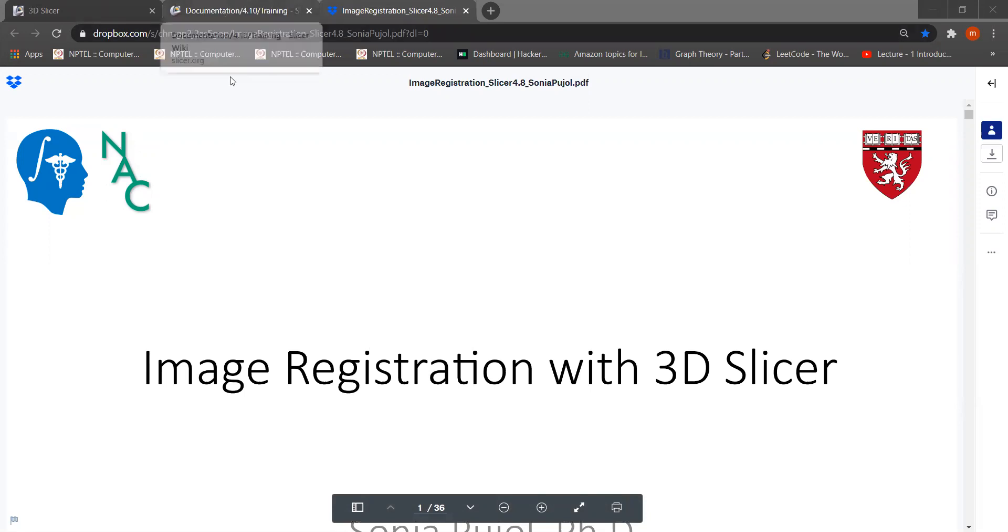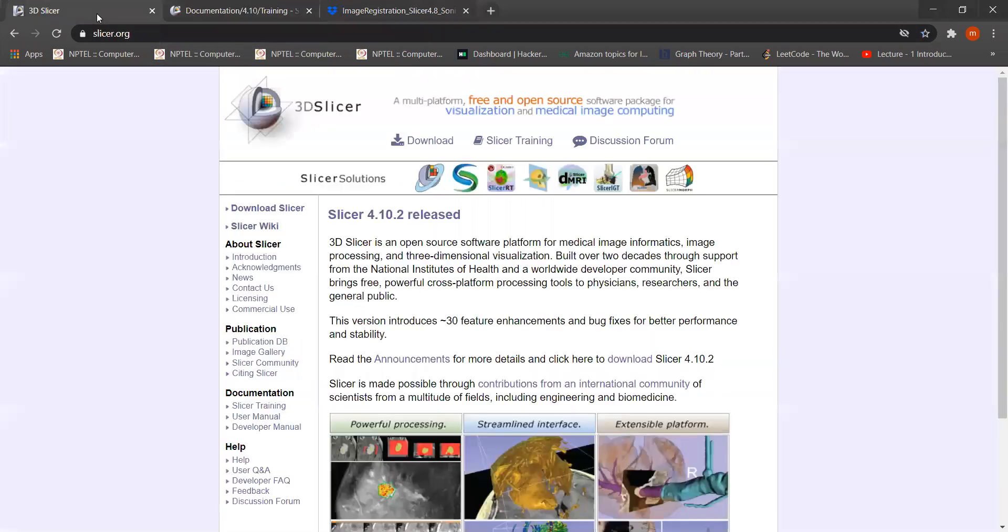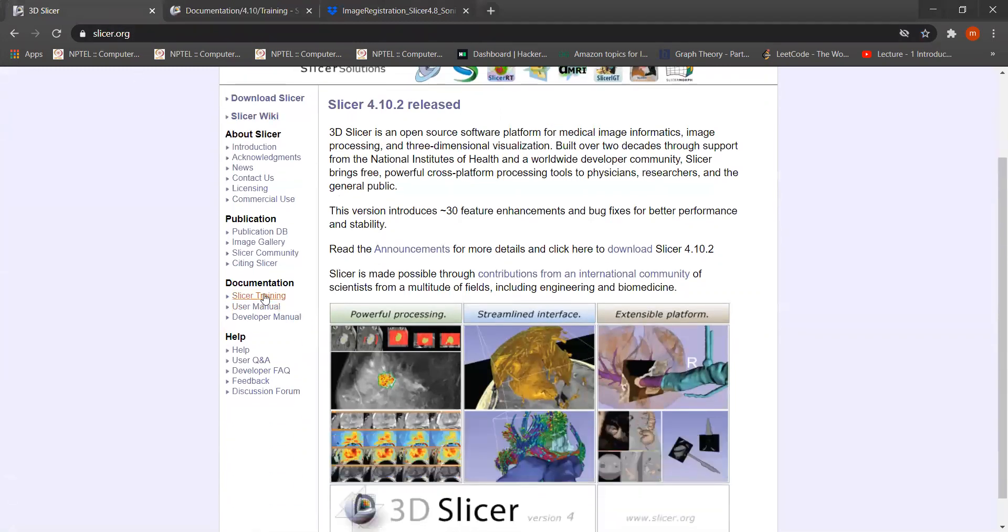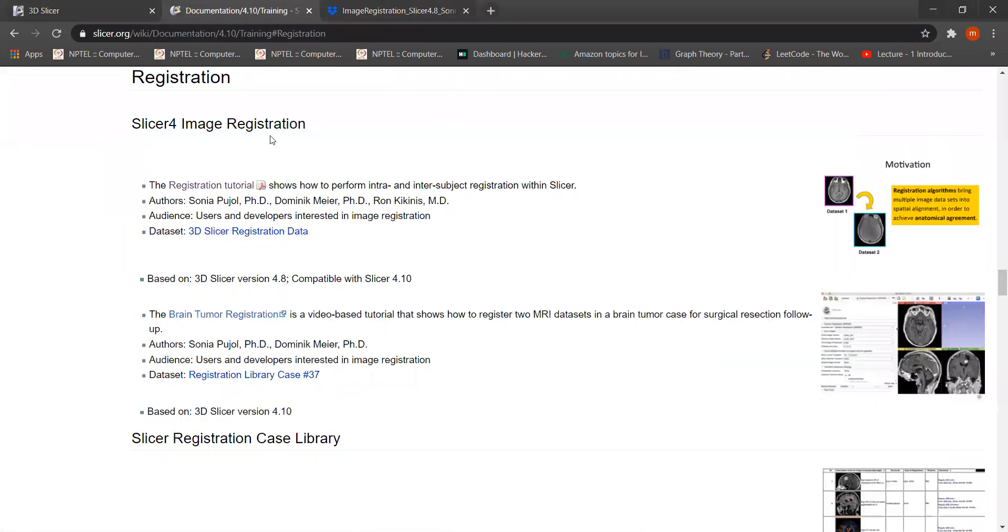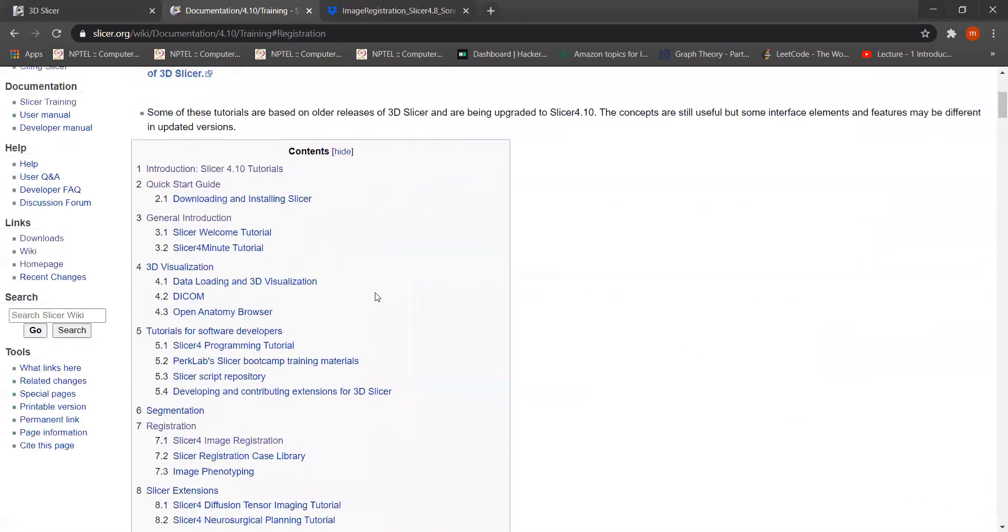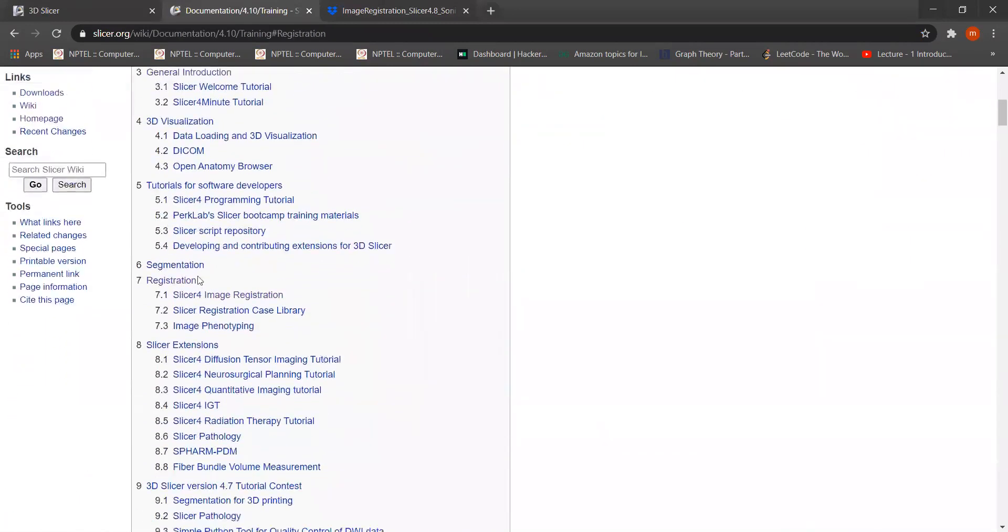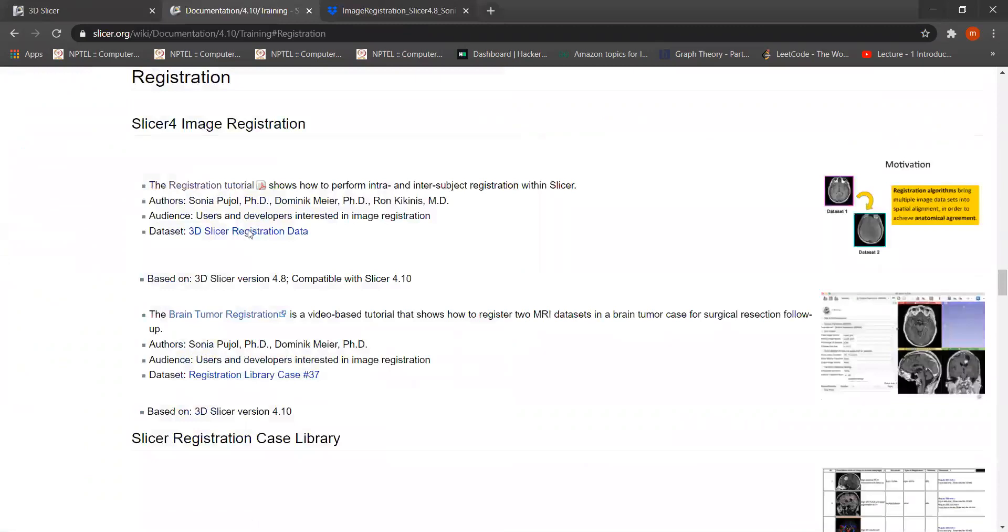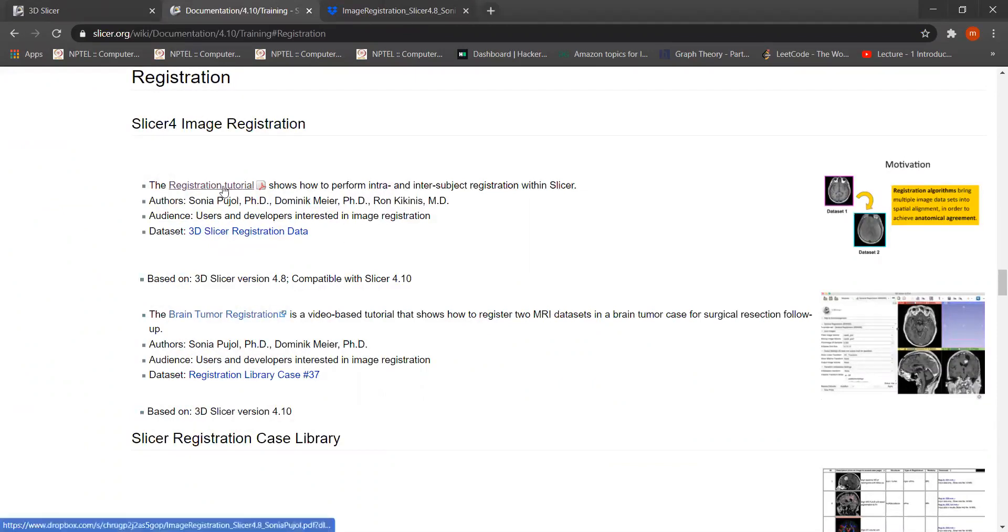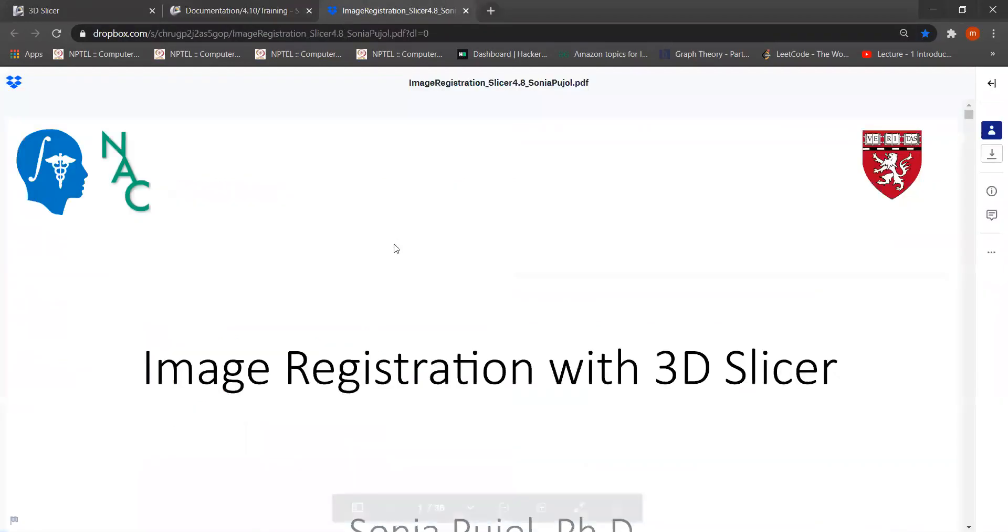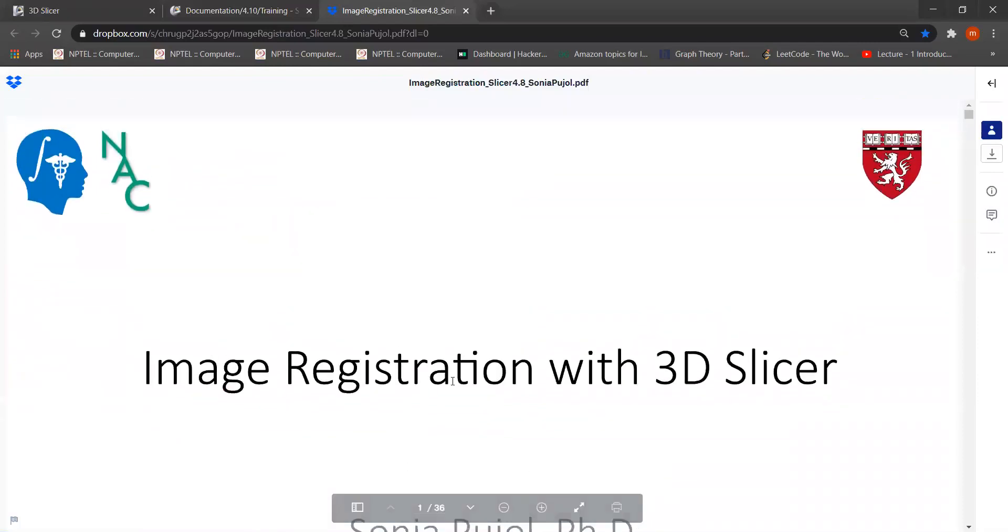I taken data from their own website. If you go through then you will see here slicer doc training, and you will go in slicer training then you will find here registration, 3D slicer registration data. And also in this tutorial, he is giving a tutorial, one tutorial for registration. This is a very good tutorial for beginners.